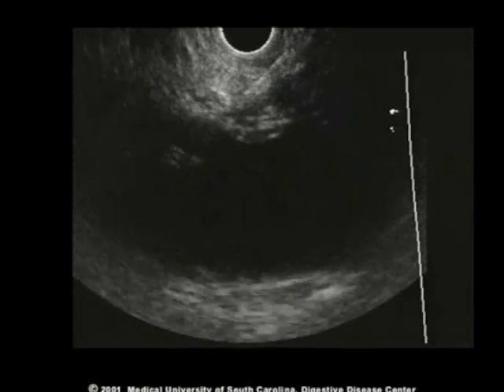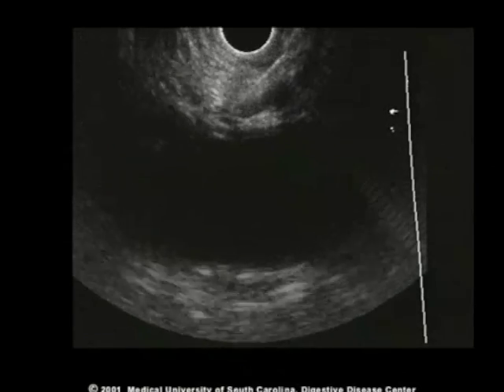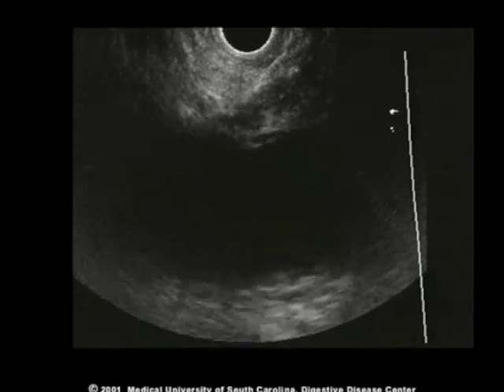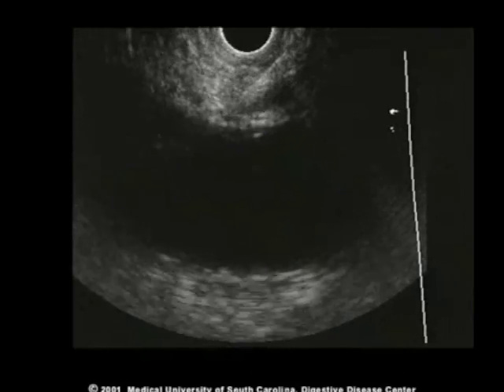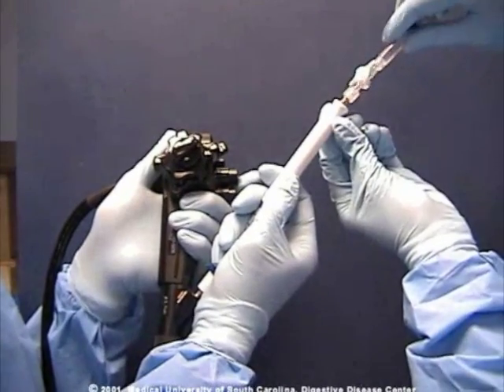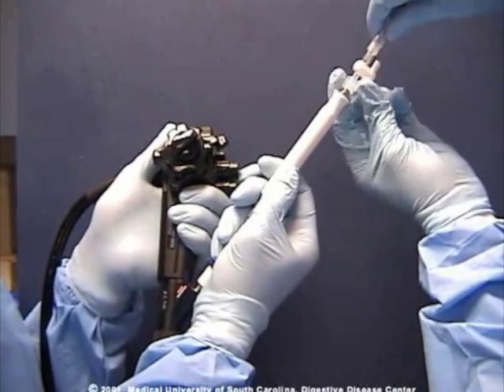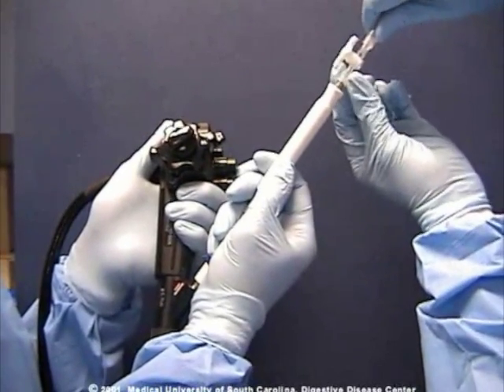An alternative technique is to rotate lateral to the aorta at the level of the celiac artery and inject half the anesthetic on one side and half the anesthetic on the other side of the aorta.